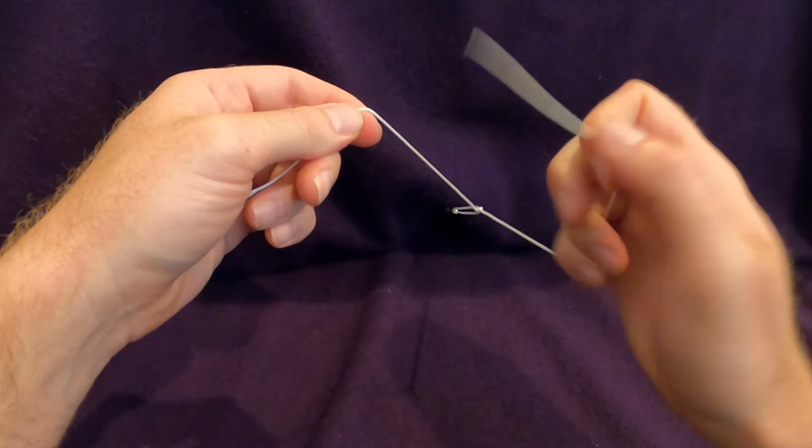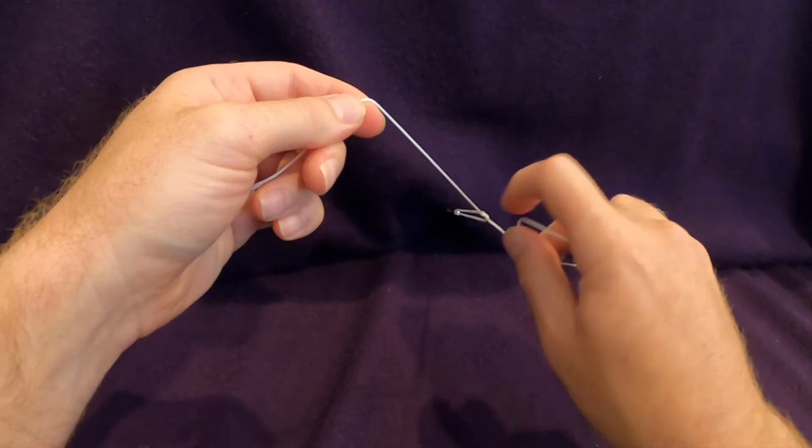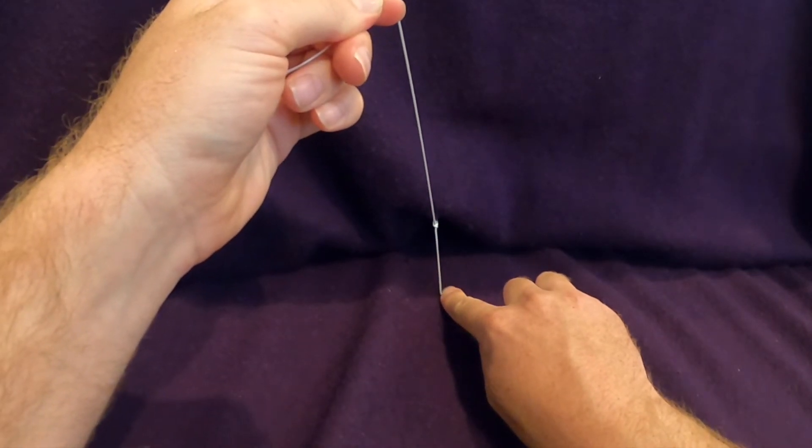When tying knots, especially in deeper holes, it's important to try to use your fingertips to push down the knot so that you ensure it's tight.